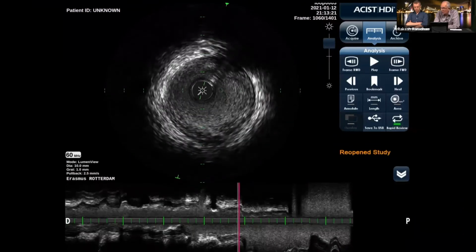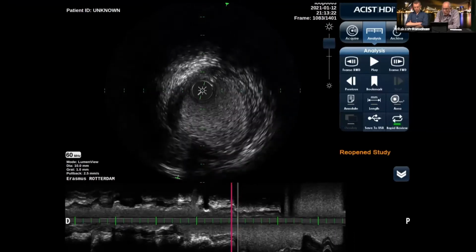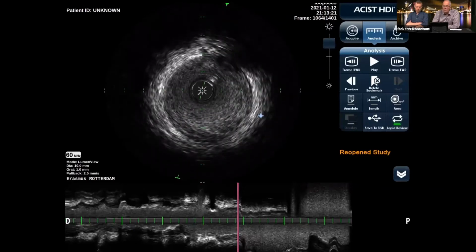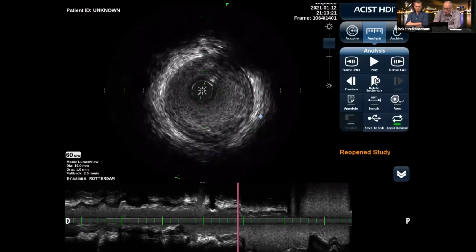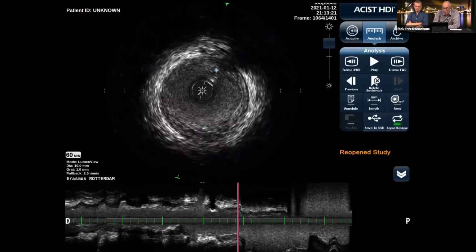So in this case, the thrombus, what are we going to do with it? Thrombectomy, check. Pre-dilatation because it wasn't enough, check. And now, if you're satisfied with your pre-dilatation, then it's time to do your measurements. Let's start proximal, though that's all up to you where you start. So you find a good landing zone, preferably one with less than 50% plaque burden.